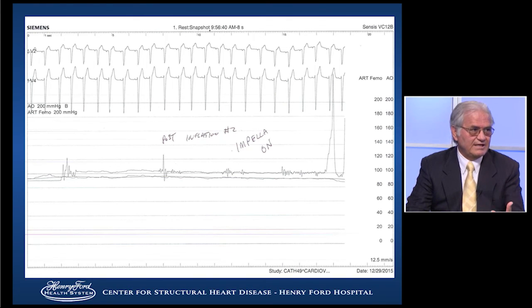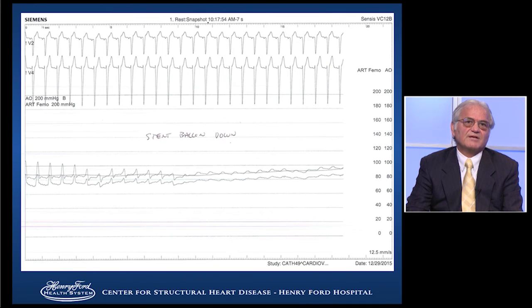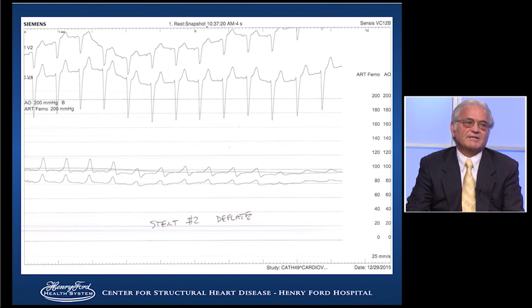You can take as long as you need with adequate hemodynamic support, and as soon as the angioplasty balloon goes down, the blood pressure comes back to normal. And we could repeat this. We had to do this multiple times to make sure that we had an adequate, good anatomic result with good apposition of both stents, to make sure that there isn't a problem down the road with subacute thrombosis. Again, you can see instantly, as soon as the balloons go down, the blood pressure comes back up. Basically, this demonstrates that you can support these patients very adequately, keeping a mean arterial pressure of 100. It allows you the time to really do a complete and thorough complex revascularization.